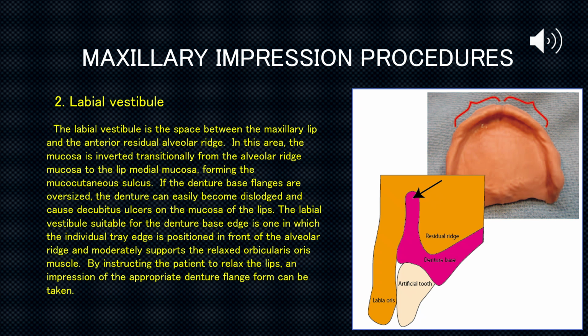If the denture base flanges are oversized, the denture can easily become dislodged and cause decubitus ulcers on the mucosa of the lips.